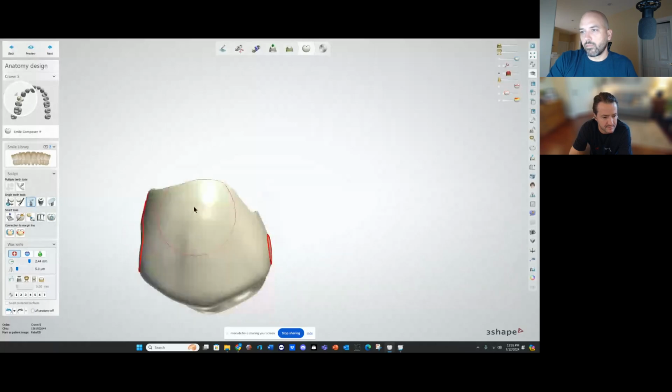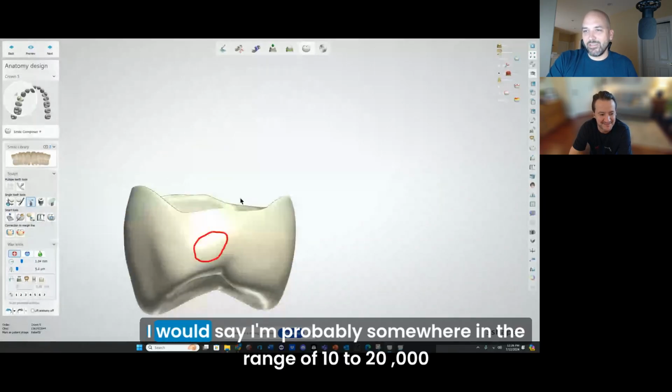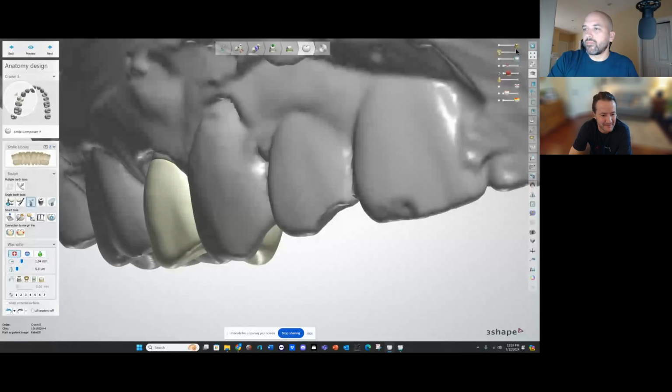How many crowns have you designed in your career, Brandon? Thousands. I would say I'm probably somewhere in the range of 10 to 20,000. Nice.